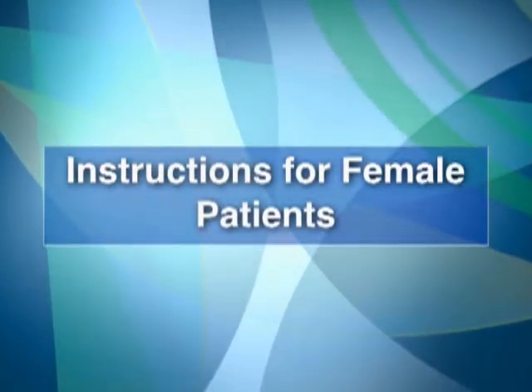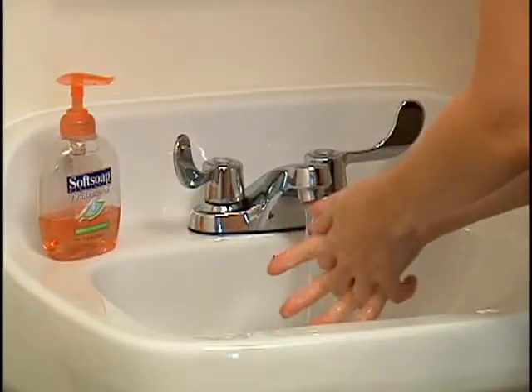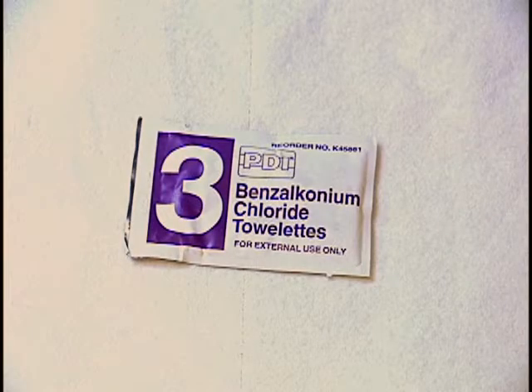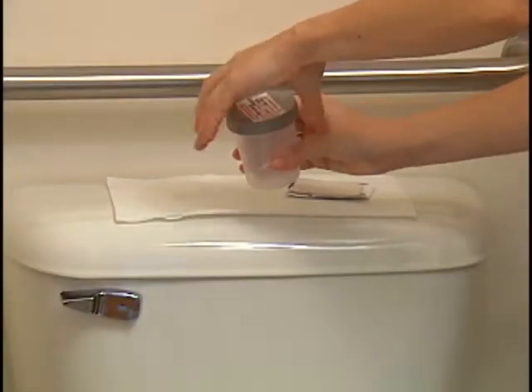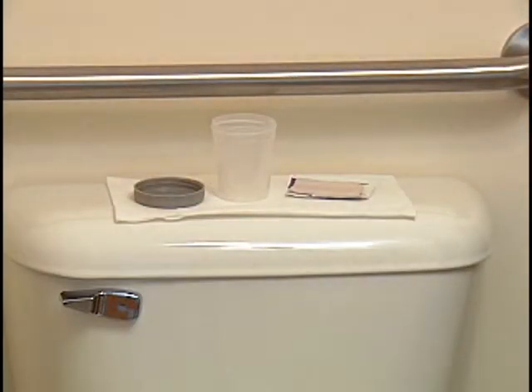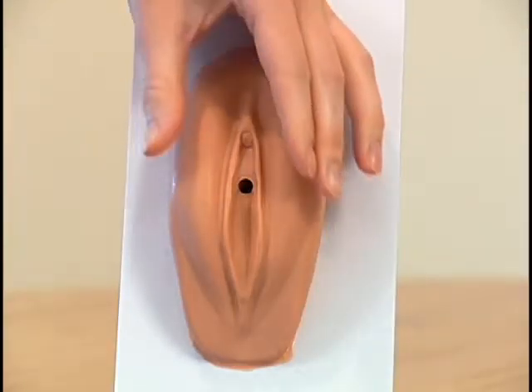The medical assistant will first instruct a female patient how to collect a clean catch specimen. Wash your hands. Open the package of antiseptic towelettes and place them on the wrapper. The towelettes are saturated with benzalkonium chloride, an antiseptic that is non-irritating to the skin. Remove the lid from the specimen container and place it on a paper towel with the opening of the lid facing upward. Do not touch the inside of the lid or the inside of the container because these areas are sterile. Pull down your undergarments and sit on the toilet.